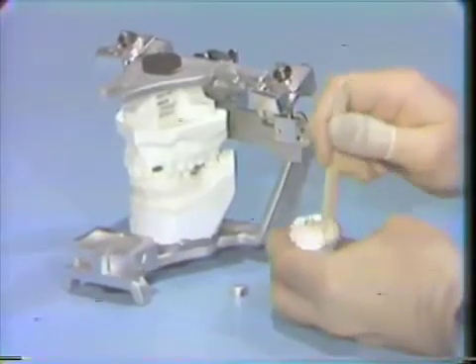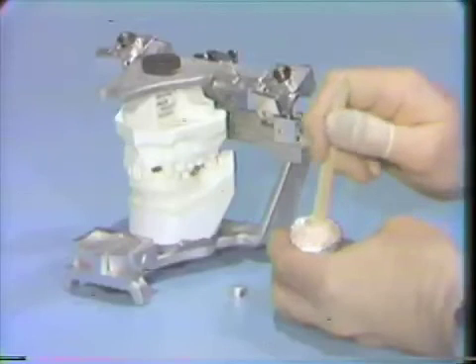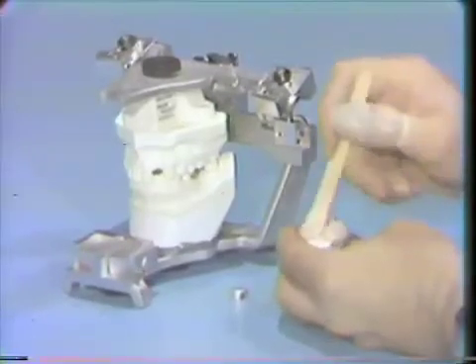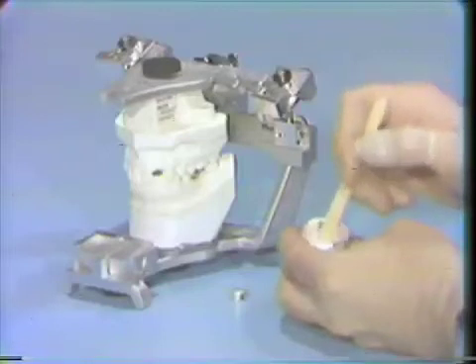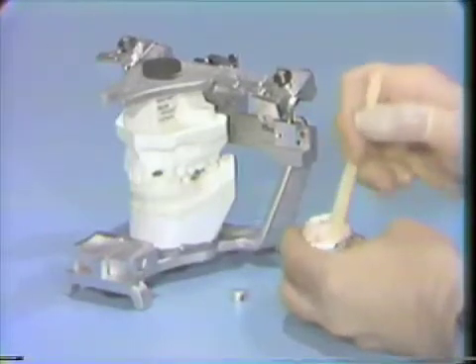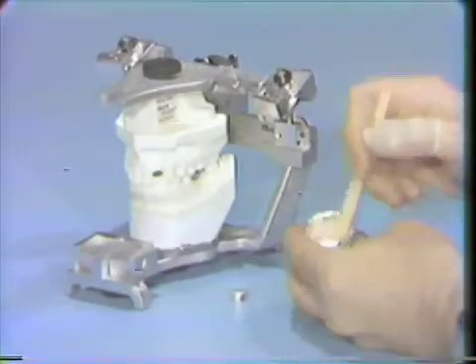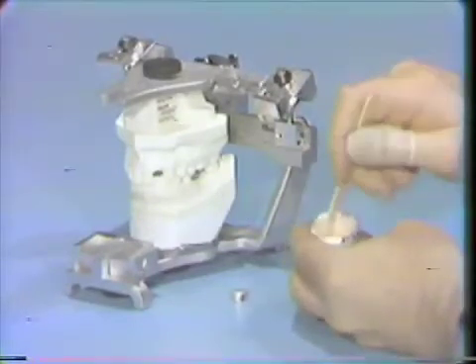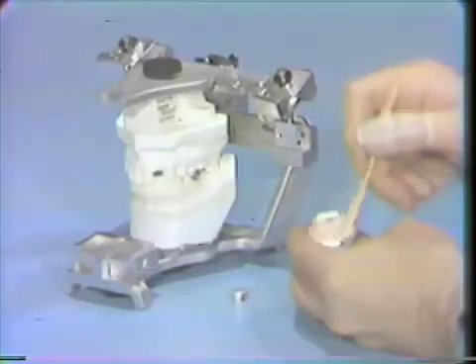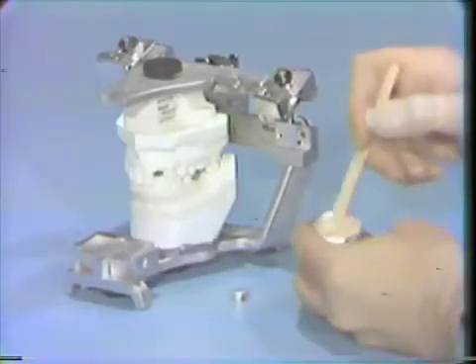The one advantage of this material is that it has a diatomaceous earth filler in it, which takes away much of the rebound and memory that's inherent to most acrylic materials. For making the platform especially, it seems to be very well suited for that purpose.